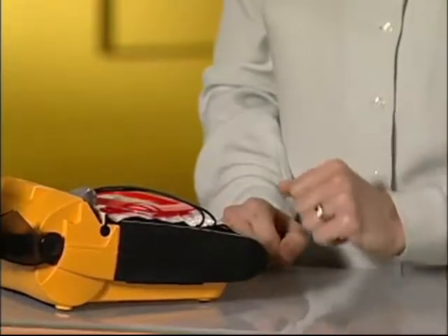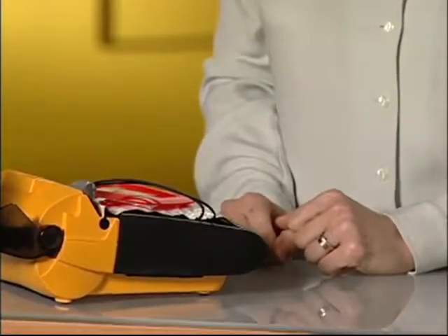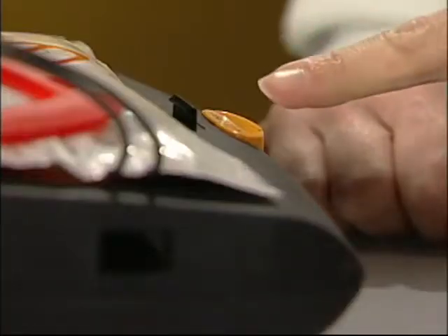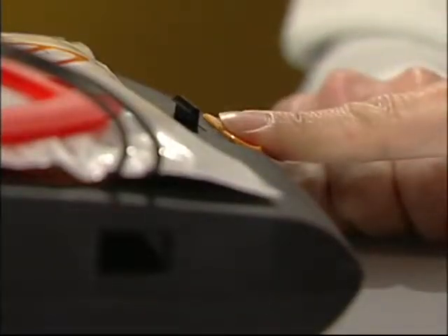Now we'll make sure the speaker is working. Push the lid release button to open and start the AED. You should hear the voice prompts. Call for help now. Now turn the device off. Hold this button for a few seconds until you hear it. Close the lid, and that's the inspection.